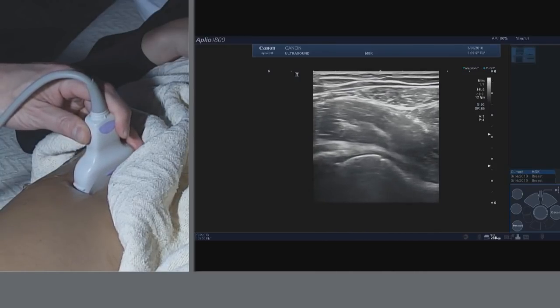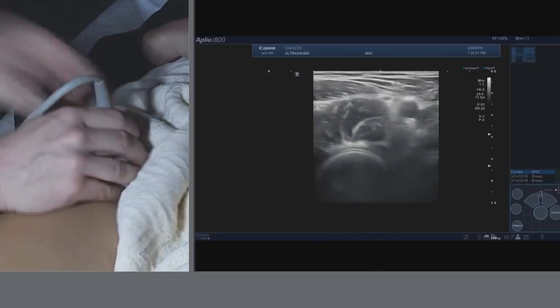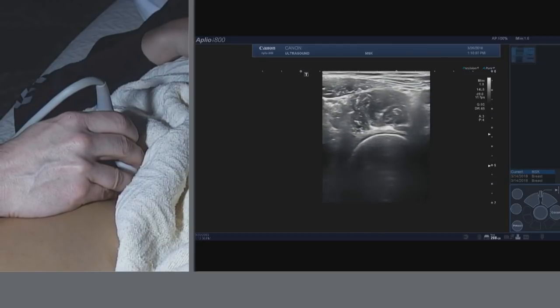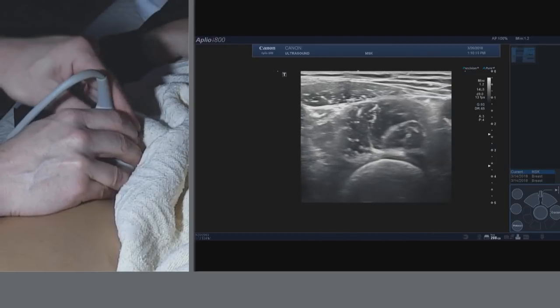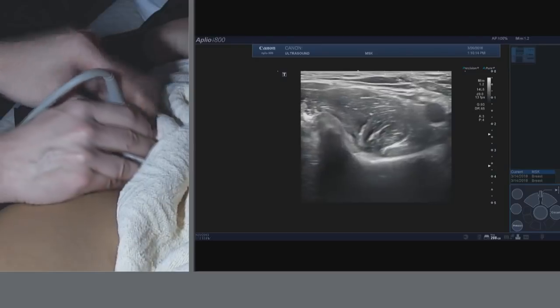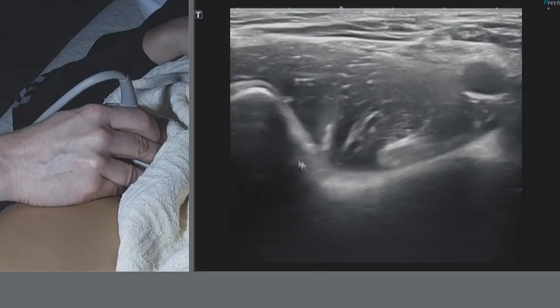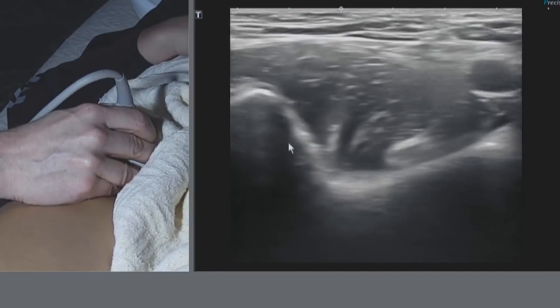What I'm going to do is slide over the femoral head. I'll turn 90 degrees. The neurovascular structures will be on the right. And the large muscle tendon unit that we see anteriorly is the iliopsoas complex. What I am then going to do is move proximally up to the ilium. So if I come up to here, I have a continuous smooth bone landmark of the ilium. And this is my landmark where I can see the iliopsoas complex. Here's the rectus femoris direct head on the anterior inferior iliac spine.